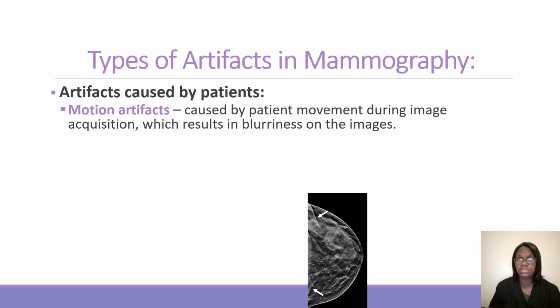The good way to do this is you can always rehearse how you are going to give them breathing instructions, especially if it's their first mammogram, because some patients really don't know what to expect. They don't know how long they have to hold their breath. And you can also give the patient a heads up, even if they have had a mammogram.